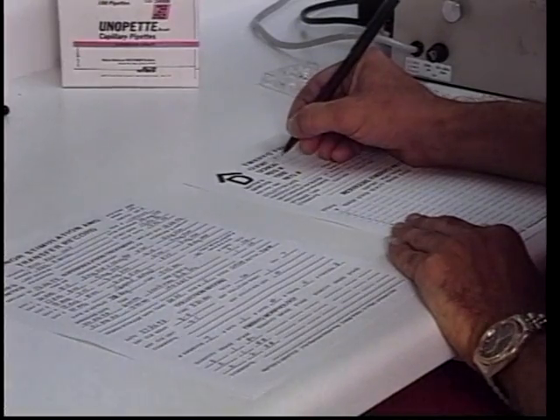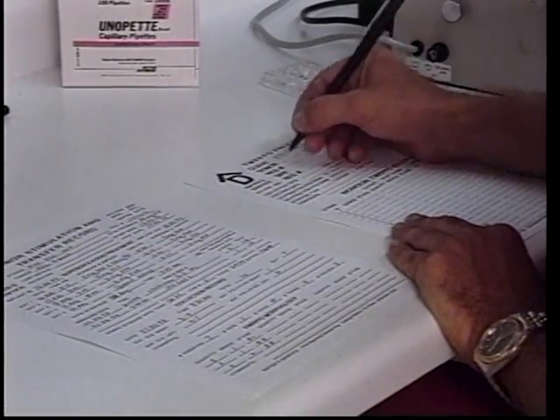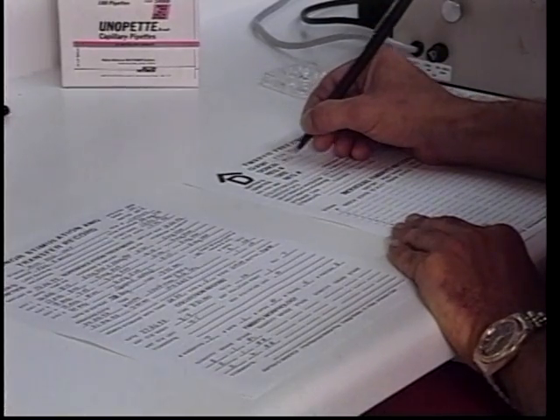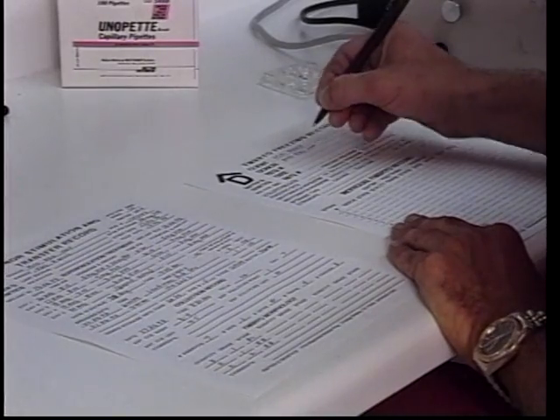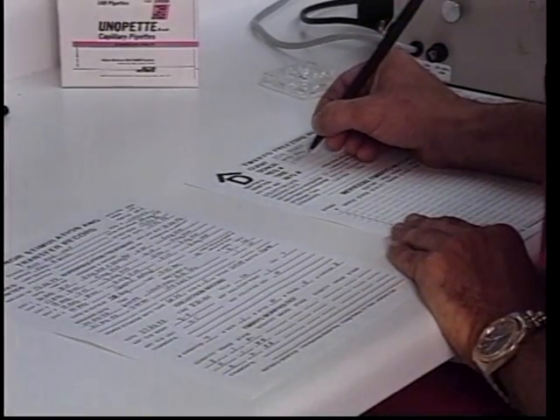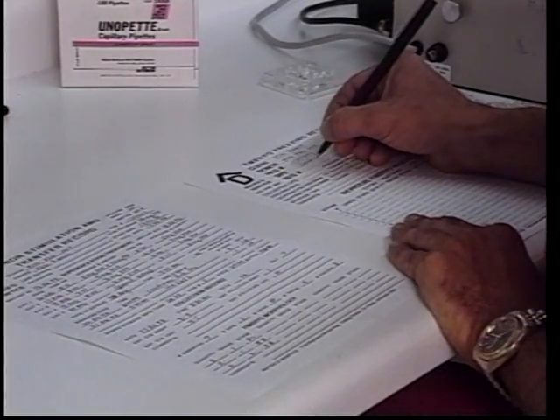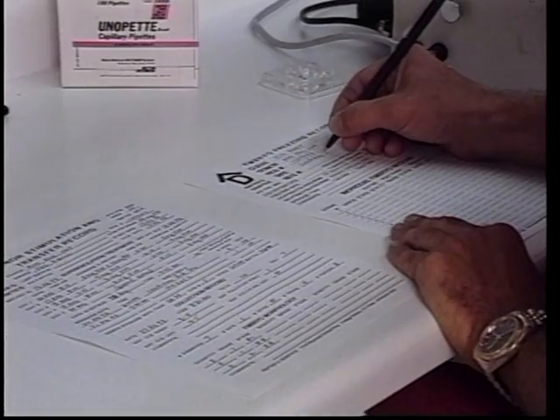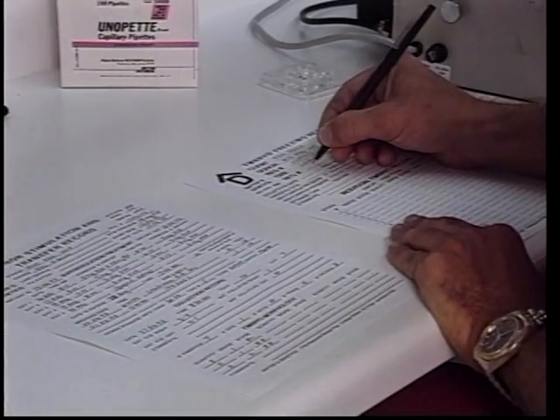While we are waiting for the embryos to equilibrate in the glycerol solution, it's a good time to update your records. A freezing record needs to be filled out for each group of embryos, identifying the particular donor and sire used, the date of freezing, and each individual embryo as far as which straw it is placed in. The records are a very important aspect of the embryo collection procedure. Proper records are the key to a successful program.